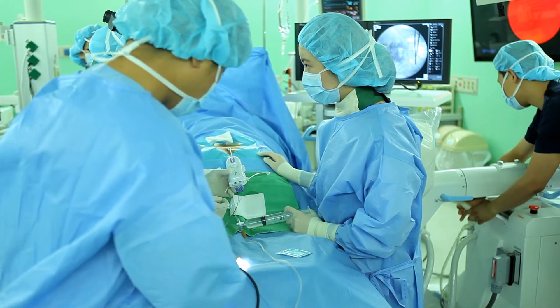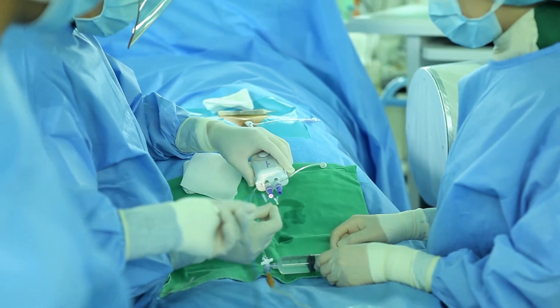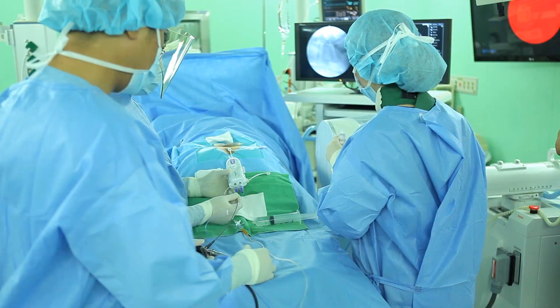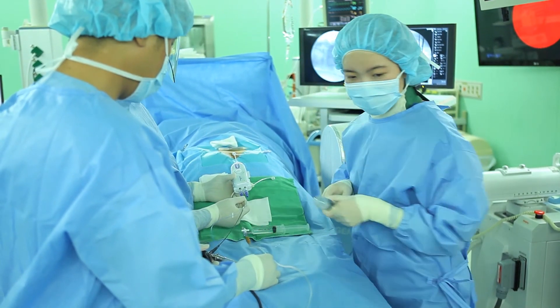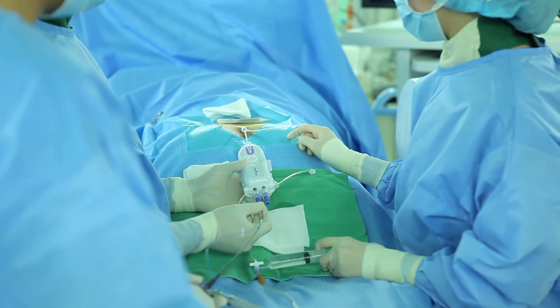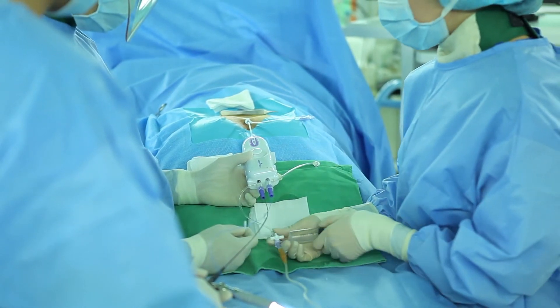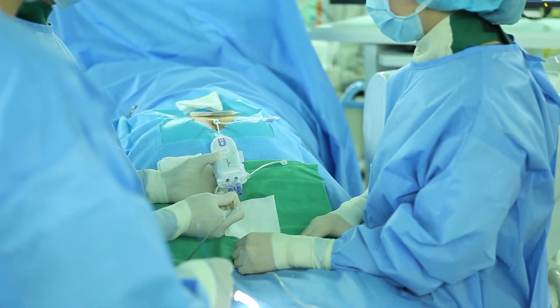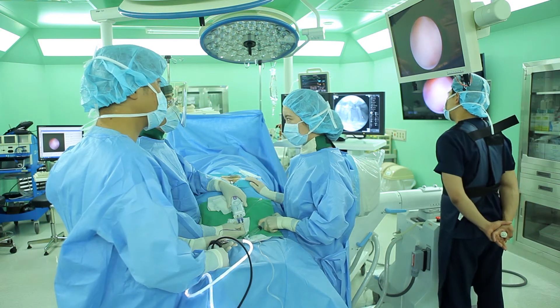Take out the endoscopic cable, then clean the cable tip with wet gauze or check any substance at the connection part of the endoscopic cable. The purpose of saline injection is to secure the way for catheter advancement and to have a clear vision around the endoscopic cable. You may continue injecting 1 cc of saline by way of pumping and you will see a clearer view during the 1 cc pumping moment. Now let's start laser treatment by seeing through the endoscopic cable.